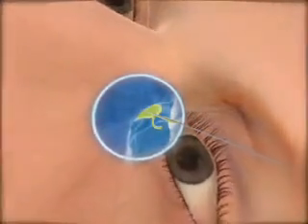The purpose of our work in the treatment of the lacrimal system is to identify techniques that are easier to perform and less harmful for the patient, using the innovations provided by endoscopy and laser technology.